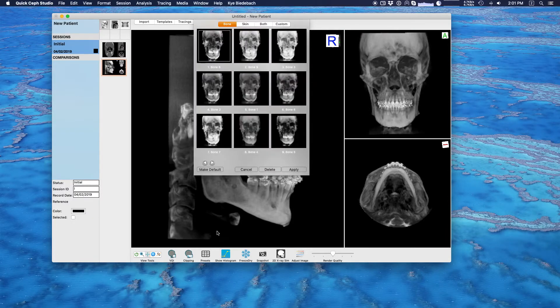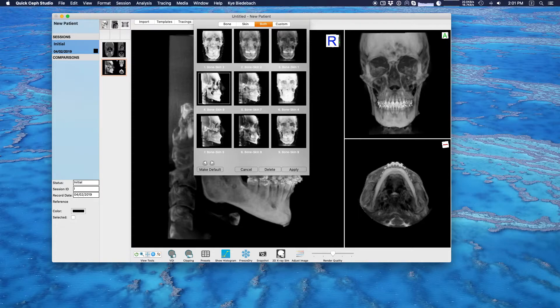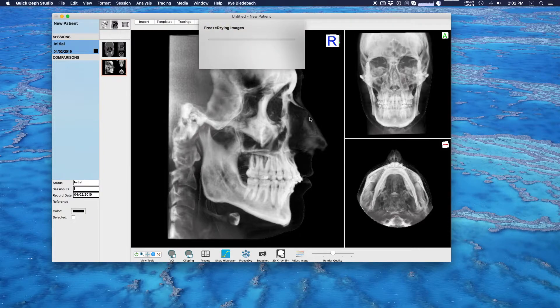Before we freeze dry we need the skin — the upper and lower profile. So go back to the presets button. We've already calibrated and straightened it, so now we're just going to apply the both — the skin. I like to rotate through these to find one where the bone isn't too blown out but there's a nice soft nose. I'm going to use bone skin five. That looks pretty decent — nice soft tissue. I'm going to click freeze dry and that's going to make the lateral, frontal, and submental vertex x-ray and place them ready to trace.